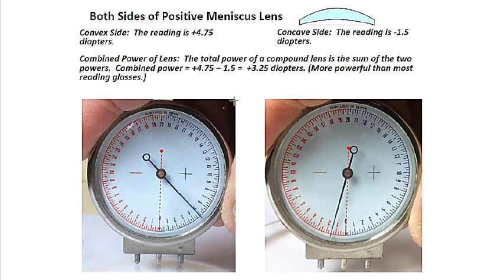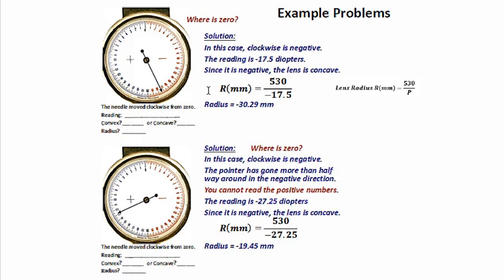Here we're reading either in this direction or the other side, because the lens is concave and convex, going this direction and then that direction without doing one revolution. This is a different diopter gauge, because it has an indication of which direction this dial gauge is going.